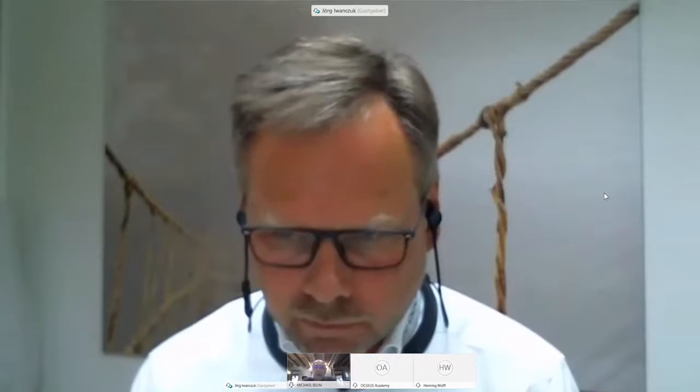The progression display, Jorg, you can intervene if my answer is technically wrong from the software, but the machine actually searches for only the best quality exams. So if you have multiple exams on the same day, it will search for the one that gives the best quality score. It will not look at maps that don't meet its own internal quality. Exactly right. So thank you.